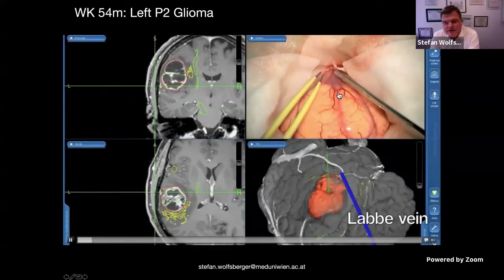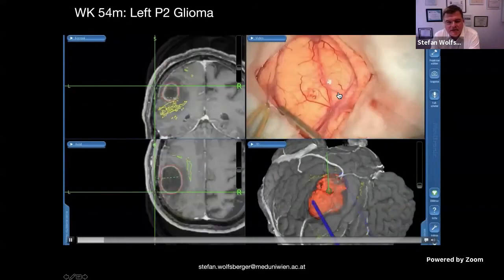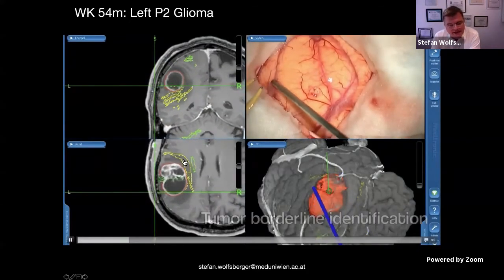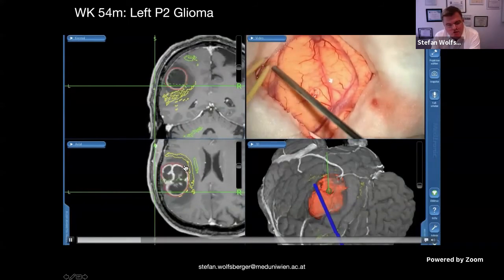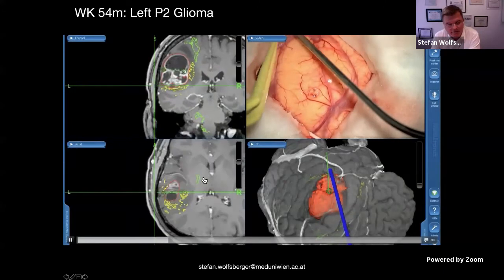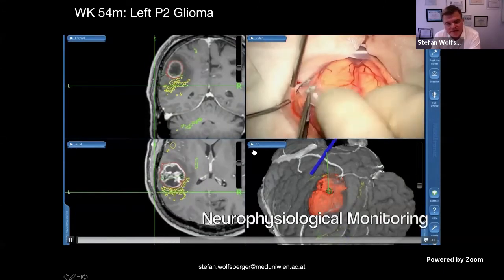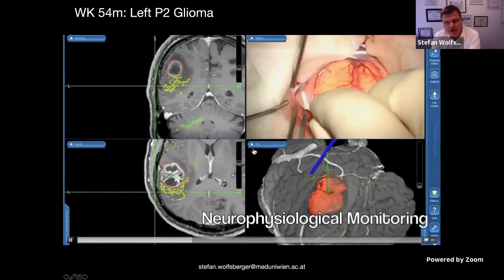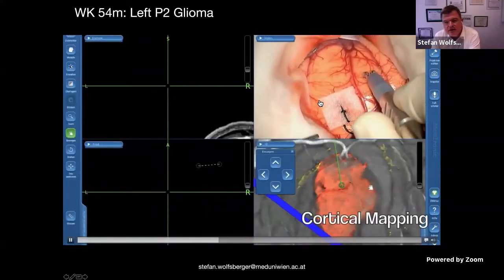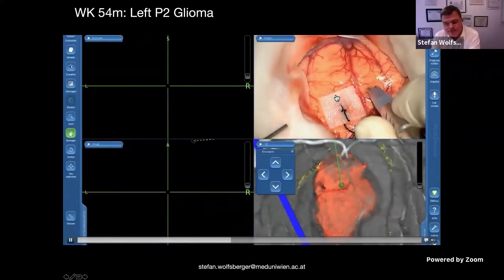And this is the video, and I hope you can see it quite smooth. But again, remember, we always had the same color code. So we immediately know that yellow is arcuate and green is corticospinal in every surgery. And we have this color code for all different fiber tracts. So here's the electrophysiology. Here's the cortical stimulation.